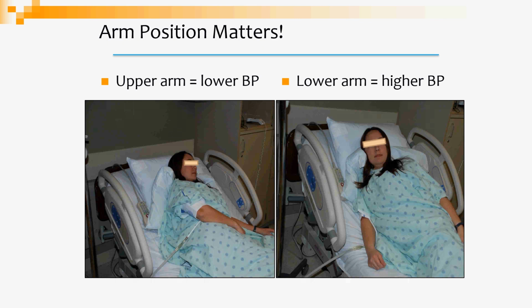So again, if you've got a patient who's, say, in labor, or she's more comfortable on one side or the other, it's still important that regardless of which arm you use, you have consistency, and that staff are taught not to switch to the upper arm to get a lower blood pressure reading because it's higher than the heart. It's important to be consistent.